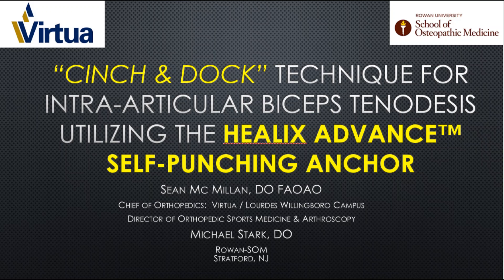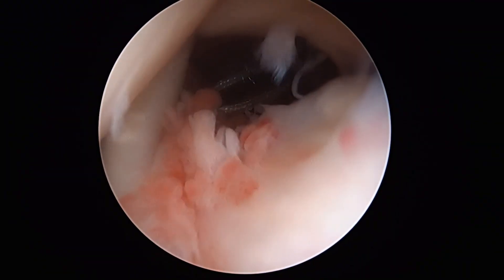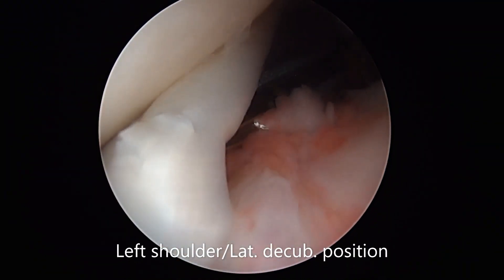The following demonstrates a simple cinch and dock technique for intra-articular bicep tenodesis utilizing the Helix advanced self-punching anchor. A left shoulder in the lateral decubitus position is seen.